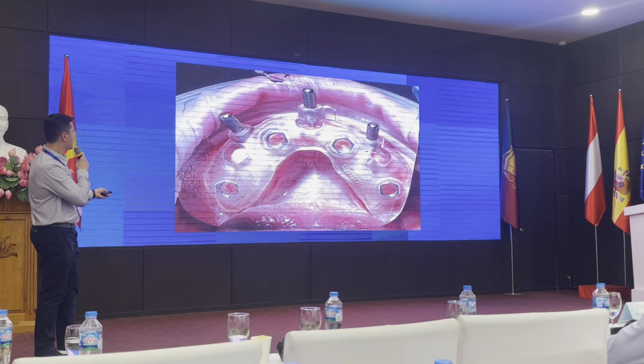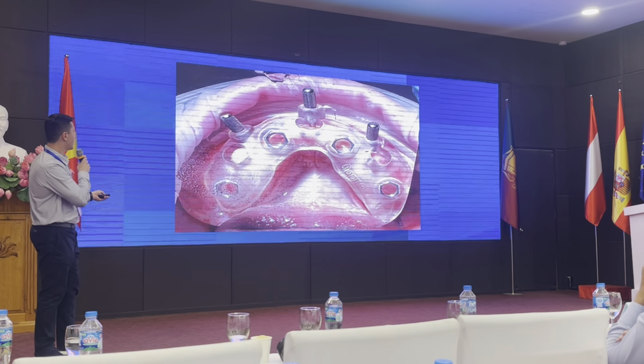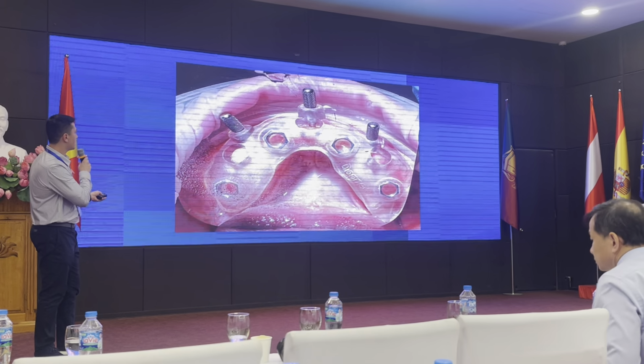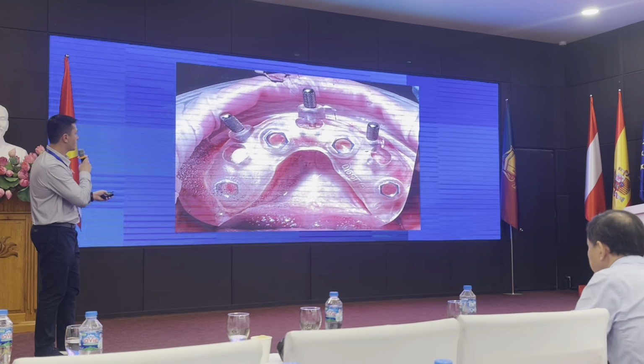So these anchor pins, you have to make sure they're pushed all the way down into the guide. Sometimes if you don't push hard enough, instead of the pin being flush right here, it's over here instead of it being right here. So you gotta make sure it's pushed all the way.